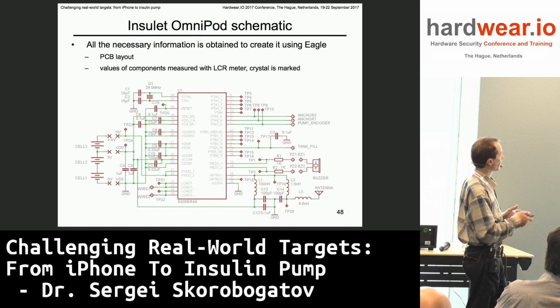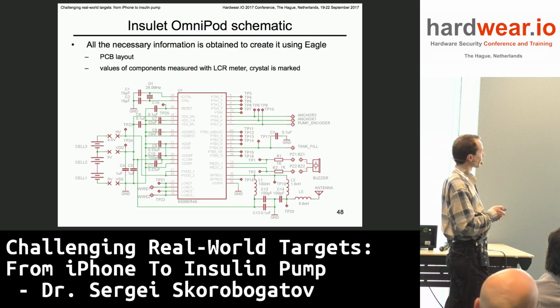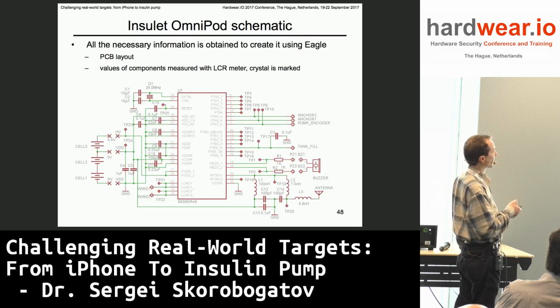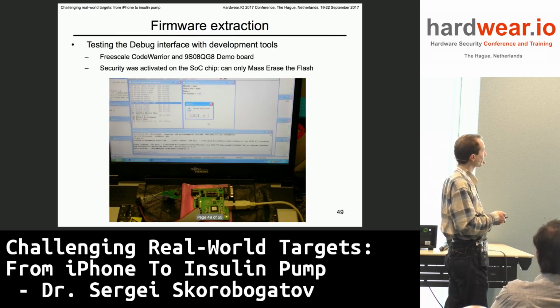So that allowed me to draw the circuit diagram of the insulin pump. You see, it's very simple. Most components are just bypassing capacitors, and the pins are directly connected to the mechanical part of the device.